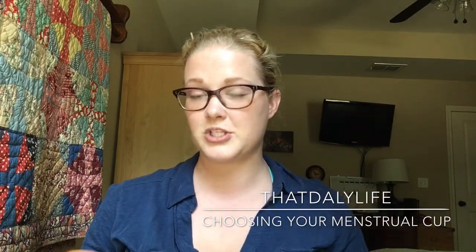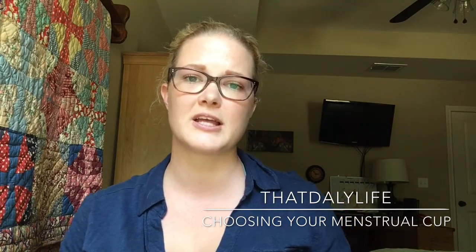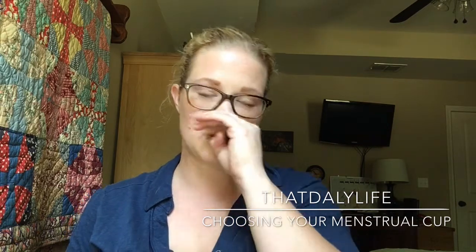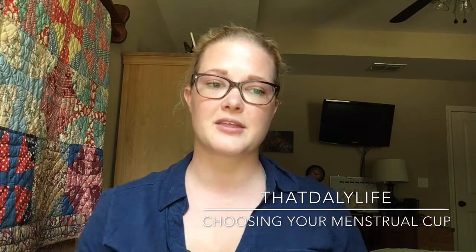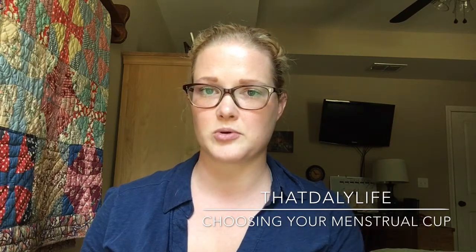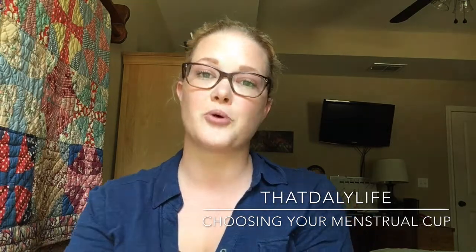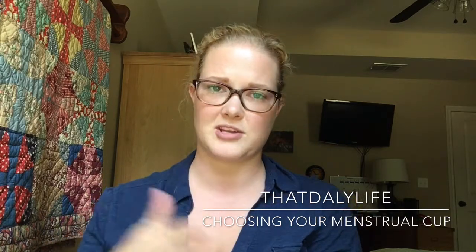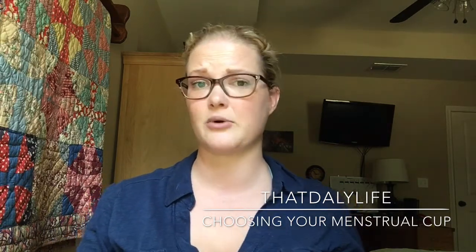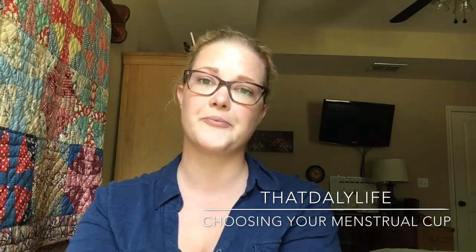The other thing you're going to want to do is cleaning. It's super easy to clean your menstrual cup, guys. Really easy. There are different tablets you can get for cleaning online that you just drop into water with your menstrual cup, they'll fizz, and then you just rinse off your menstrual cup. The other thing that I do, which is what's recommended inside of the instruction manual, is to boil your menstrual cup. Each menstrual cup could possibly say a different variation of time. Normally it's between 5 and 10 minutes to boil, and then you let it cool. And that'll sanitize your menstrual cup for you.